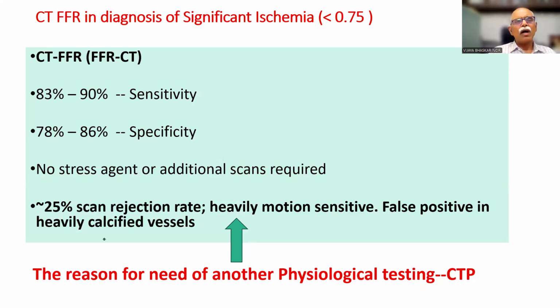Now, there is one more interesting and very accurate modality known as CTFFR. CTFFR is also very useful as a physiological testing to pick up hemodynamically significant ischemia when it's less than 0.75.